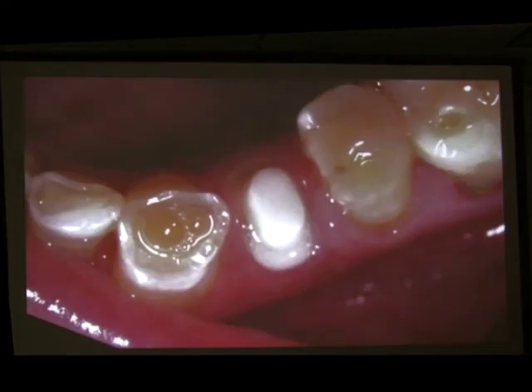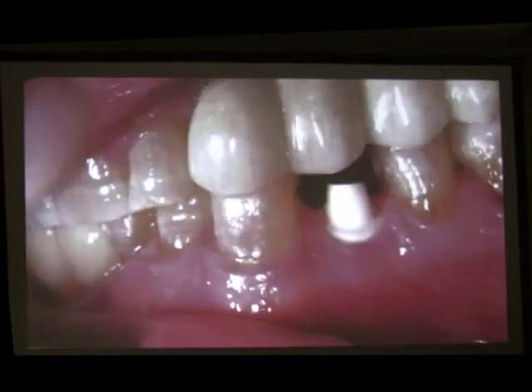For 4 months post-op, if we have gum covering the implant, you can use the coping, you can use retraction cord because it's not a delicate area, and you can use electrosurge or laser to have access to the implant shoulder.